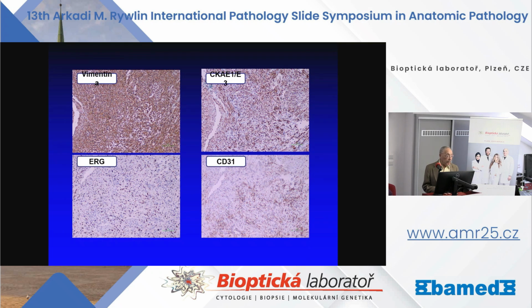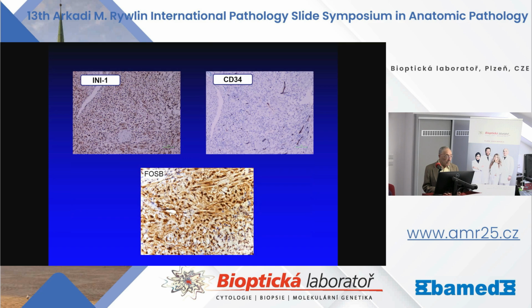It was positive for vimentin, cytokeratin, ERG and CD31. INI1 was preserved, CD34 was negative. But this FOSB was completely positive.